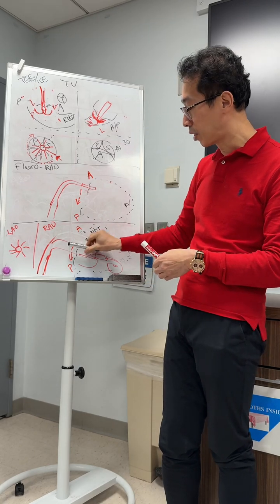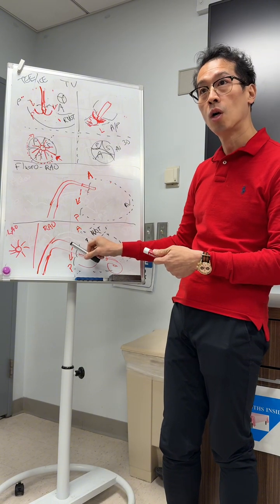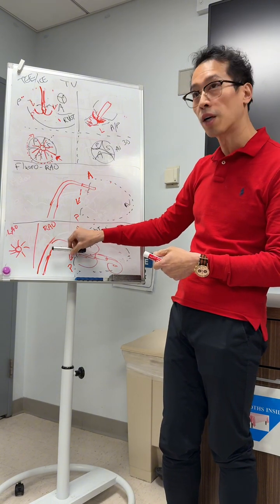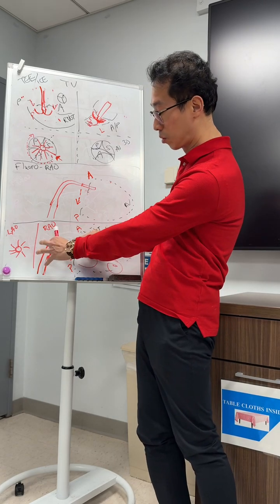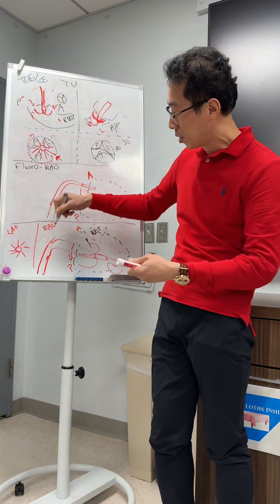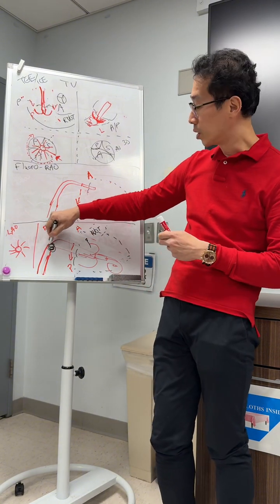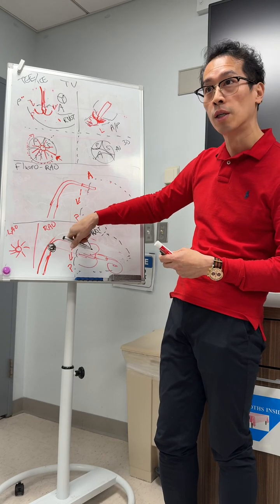Either you unflex to bring it up, but then you might actually change the trajectory. Or you might withdraw the system, unclick, right? You click back and let it tilt up like that. Remember that this is the pivot point, because you're pivoting at the bottom. So you're pivoting here. Remember that's what they did in training.